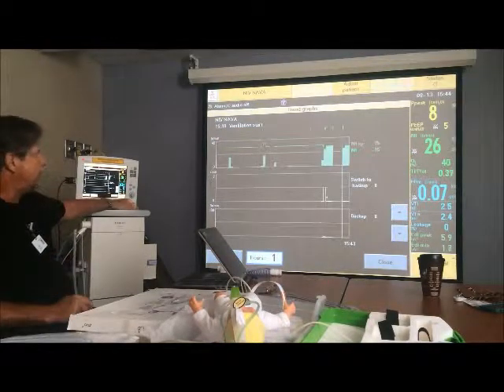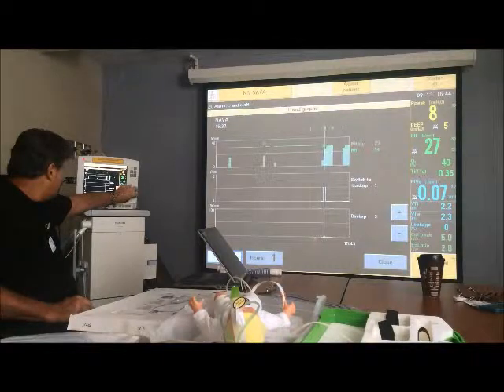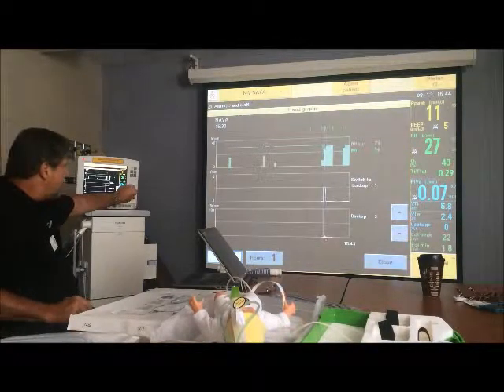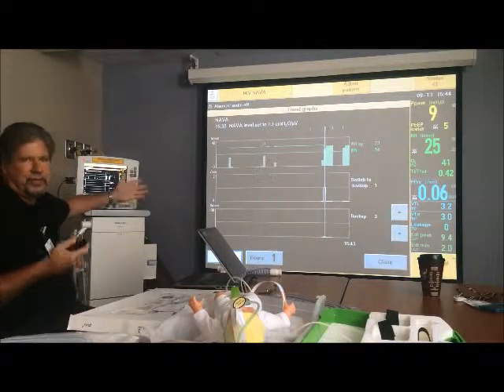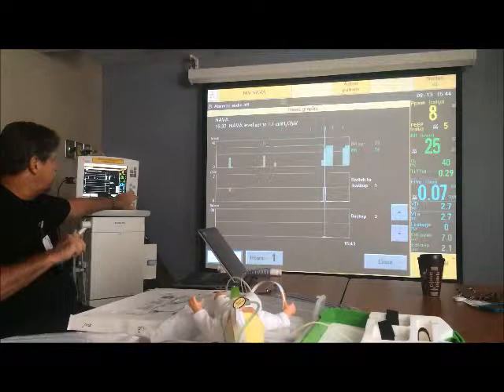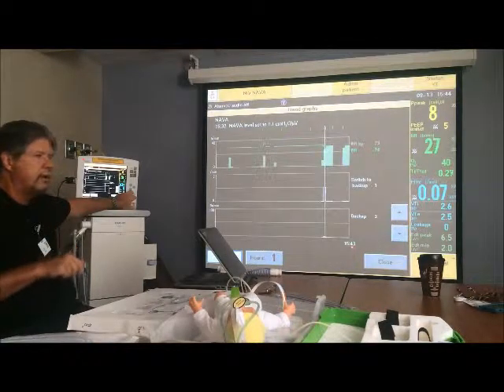okay, there was a switch to backup. That's what it looks like. So we had a switch to backup at 3:32, and he was in backup for 3% of 1 minute. Basically nothing. So what would happen then, the first day you see this and another one and another one and another one, so you go 1, 2, 3, 4. He had 8 switches to backup from 2:40 to 3:40.